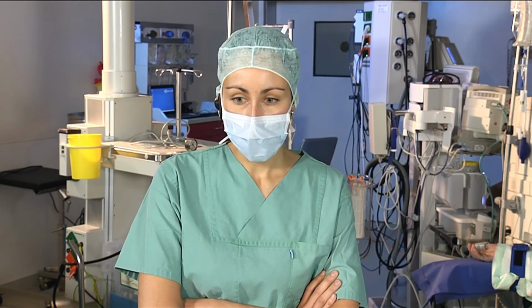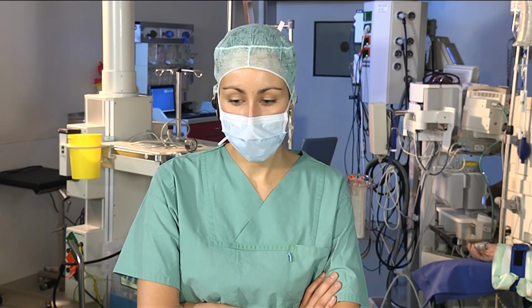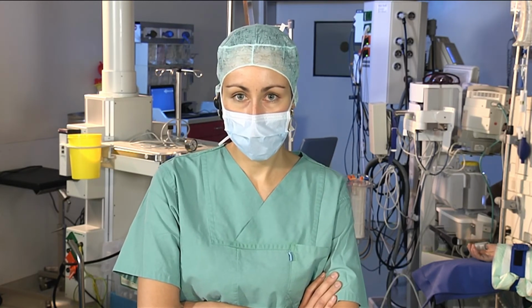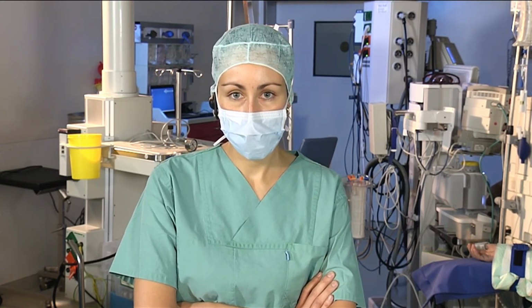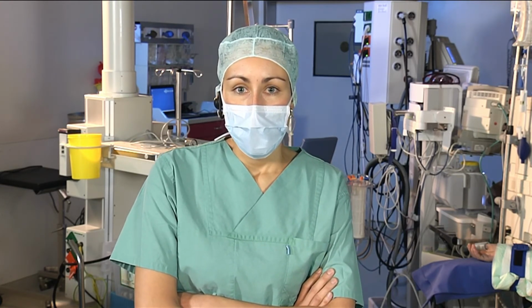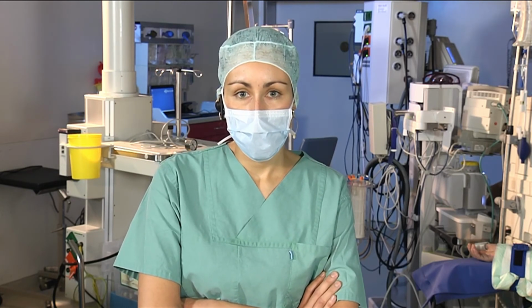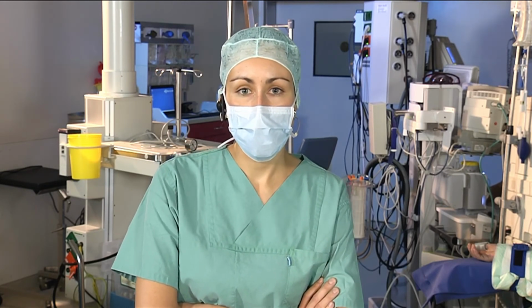A question from Gerd Willem. Hi, Dr. Schuring. I did one of these candy plugs, and then I was told to push up the tail. I didn't see you do that, and in my case the celiac trunk came from the false lumen. So now your tail is hanging into the false lumen. Right. You don't push it up anymore?